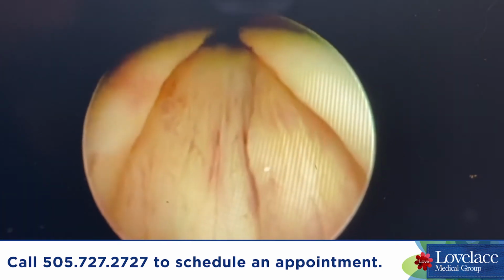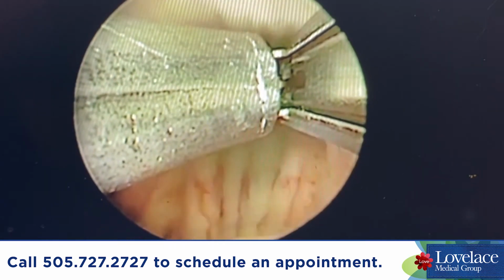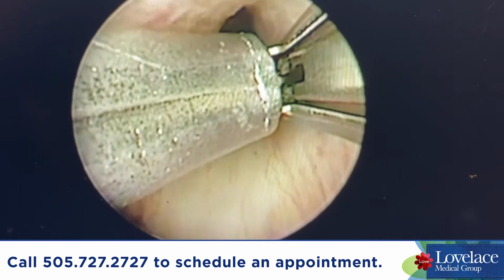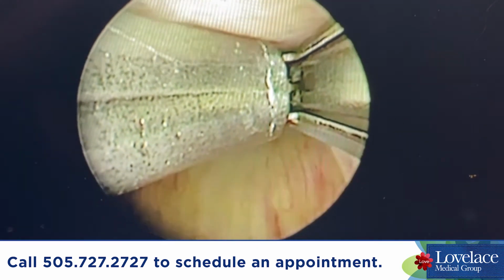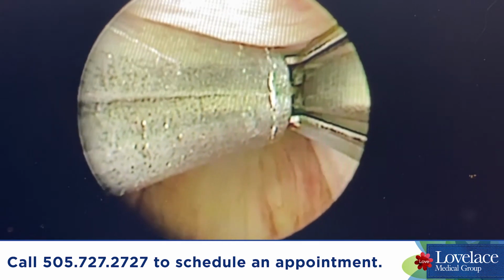So what we're looking at here is from an actual case. And this is the view that the surgeon has while he's looking through the endoscope, which is the device that allows us to see within your bladder.